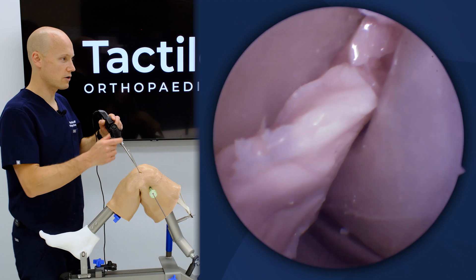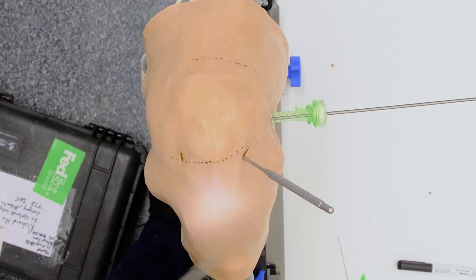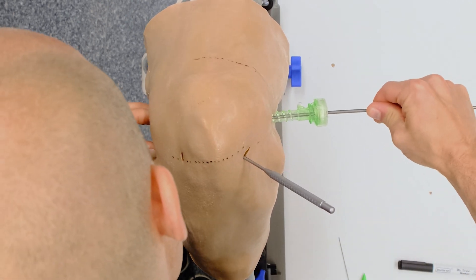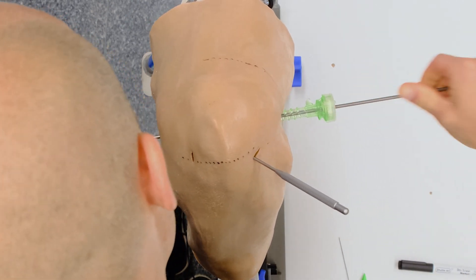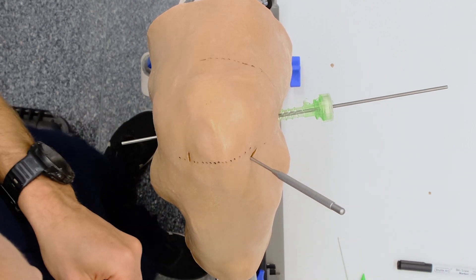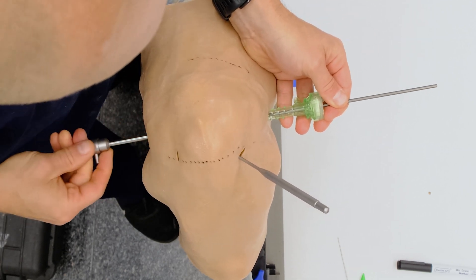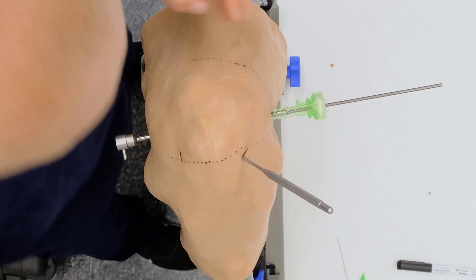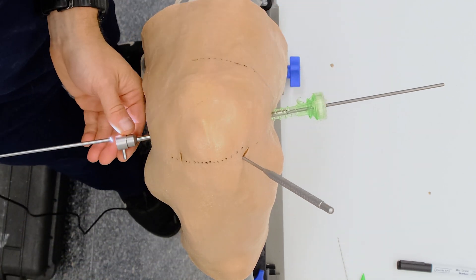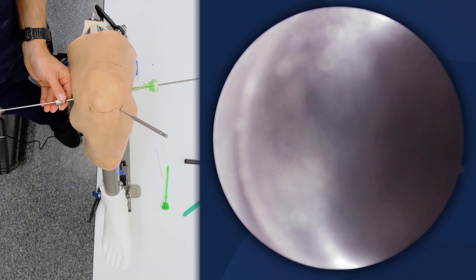Now because the lateral compartment has been locked in, we know the trocar is going to stay posterior. I drive it out inside-out, then take my cannula, advance it into the cannula, and whisk my wire — pushing that out.